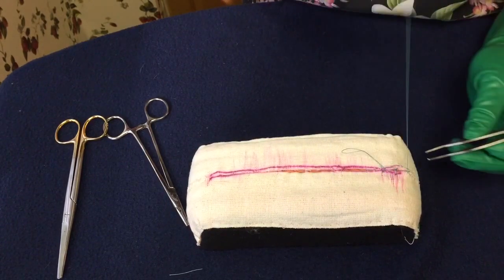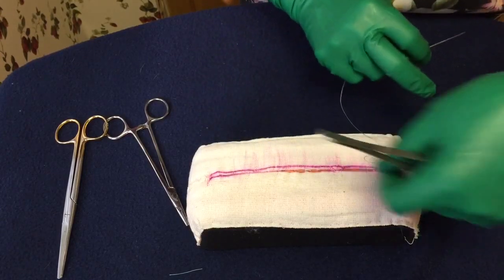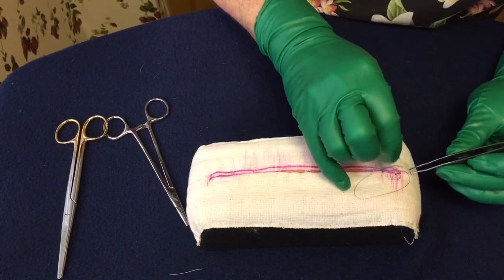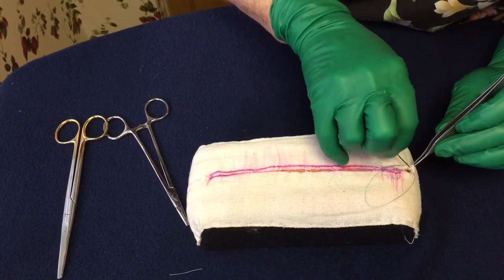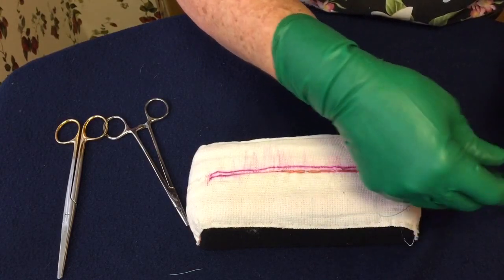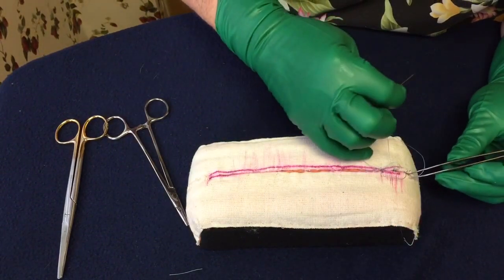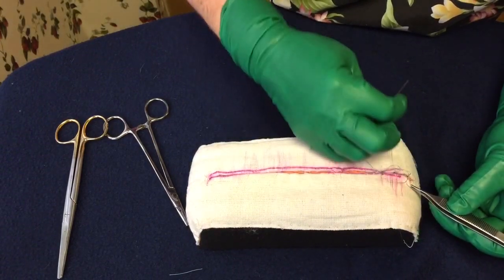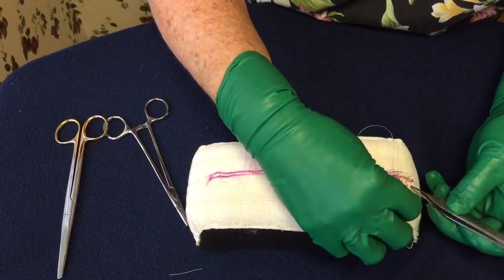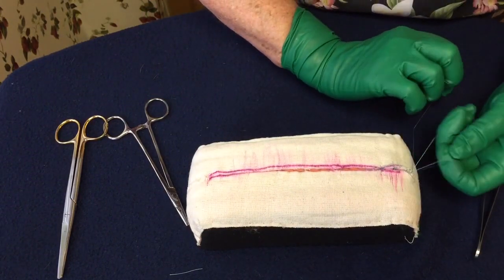This next stitch is the reason why I don't want to pull it tight — I want to be able to go in at this end and go deep. I start here, take my Keith needle, and go deep on this side, then do the same on the other side. I can pull the skin up, evert it a little bit so I can see. I go from shallow to deep in the corner — deep in the corner. Now I can tighten it.